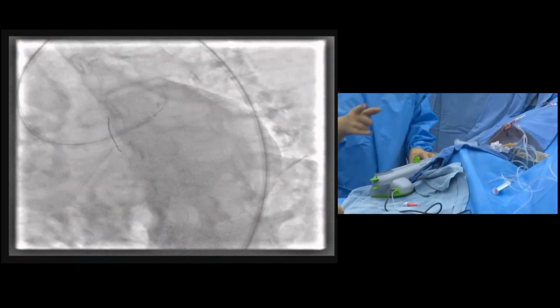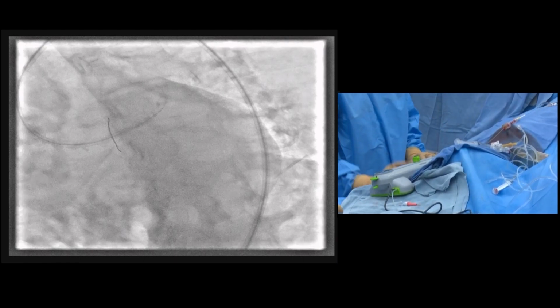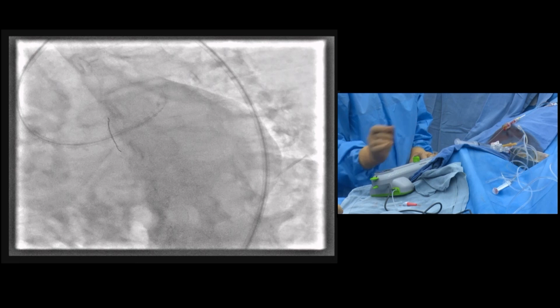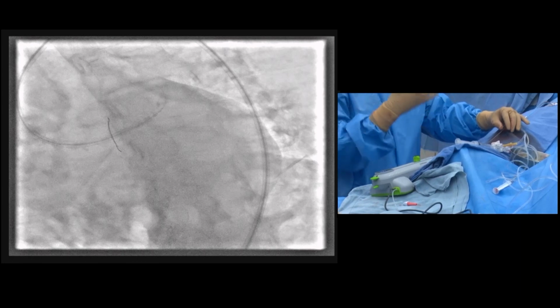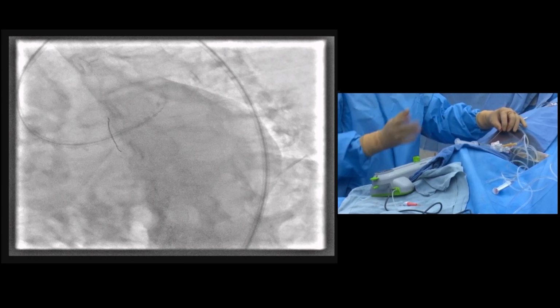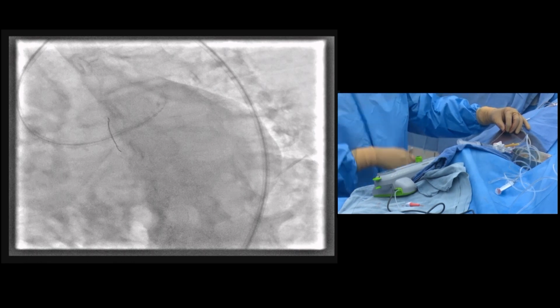So when you start the orbital atherectomy, the brake should be activated, press the knob, and the advance knob should be pressed, and then do the forward and backward cutting. The speed should be very, very slow, just 1 mm per second. At that time give enough ablation, then gradually move backward. Very slow movement is very, very important. With high speed, ablation capacity is less and complications are more.